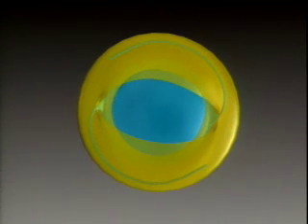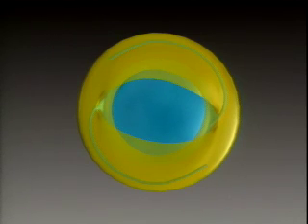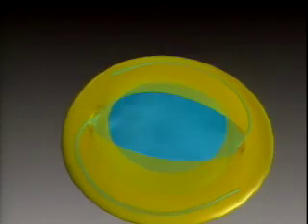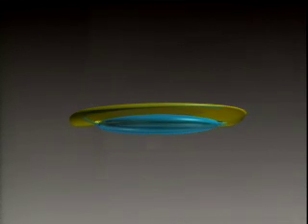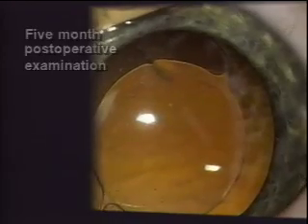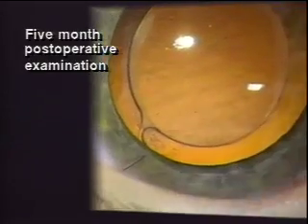Residual epithelial cells should either form a Soemmering ring or be released into the aqueous anterior to the IOL. Any adhesion of protein on the anterior surface of the IOL may be cleared away with the YAG laser. The five-month post-operative examination of the surgical case previously displayed provides evidence that the visual axis has remained clear without secondary membrane formation. There are, however, a few pearls on the anterior lens surface.